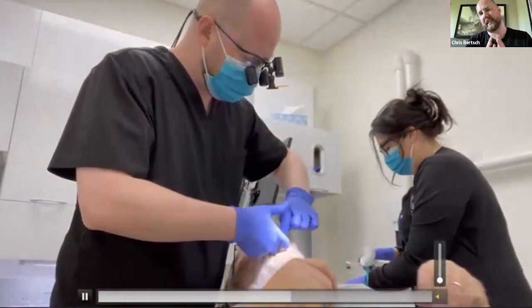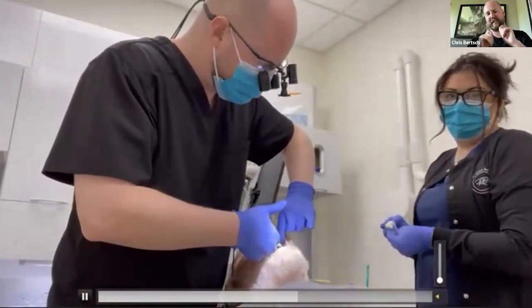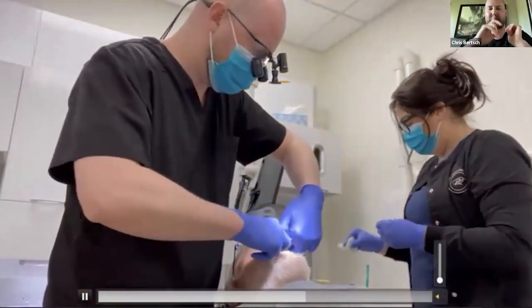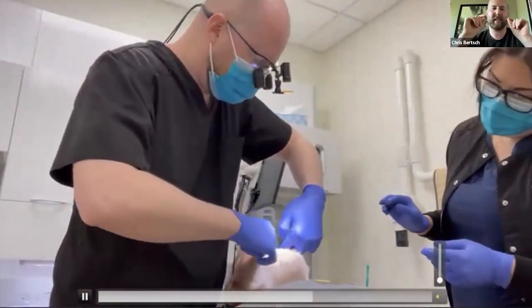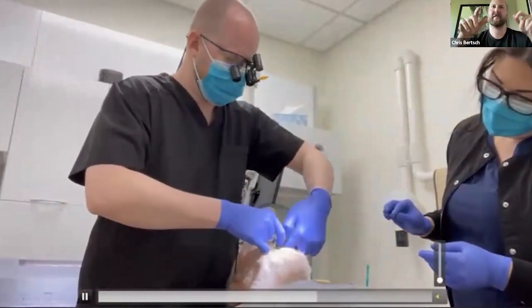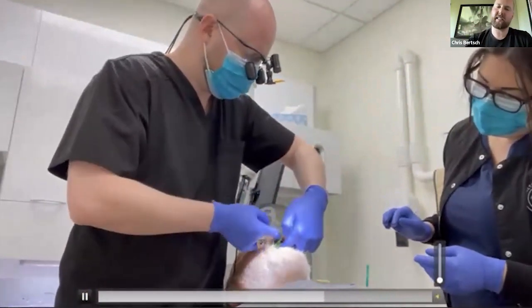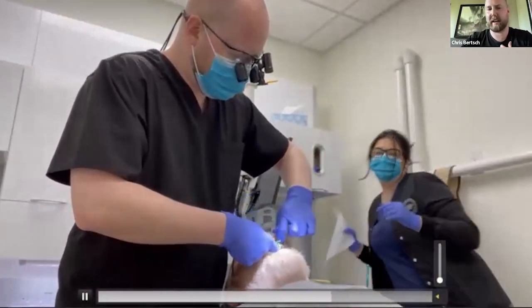And I can't remember if I said this earlier, but before we do any of this, when I was doing that first video of the border movements, always make sure there's space for the frenums, because oftentimes with the digital dentures, the immediate denture, the frenum space isn't as nice as you'd want it. So make sure you just kind of cut a notch in the denture before doing this reline.